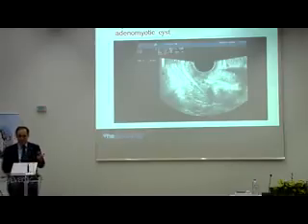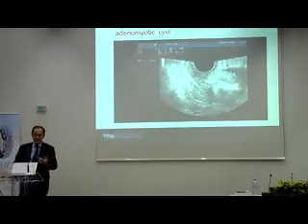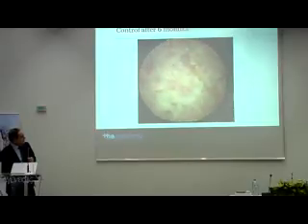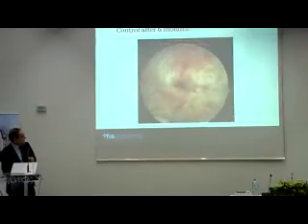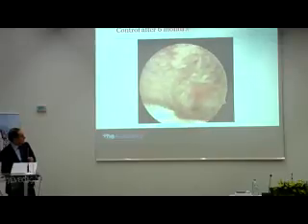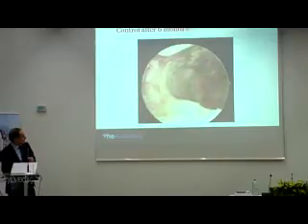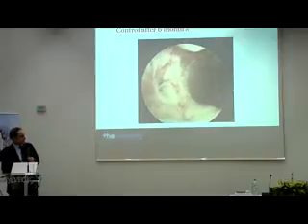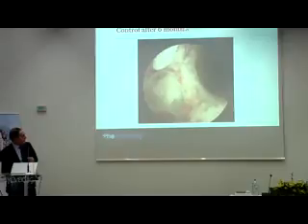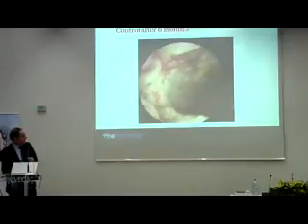Now we look at this woman 6 months later, because it did not work very well. She did not get pregnant. And what do we see? Look carefully. The ostia look a little bit red. The ostium, no polyps anymore. And we see here the little defect, but actually it looks very nice, except for this protrusion, which you will see here.